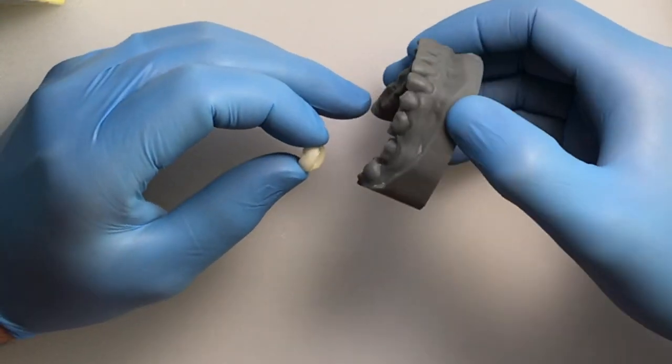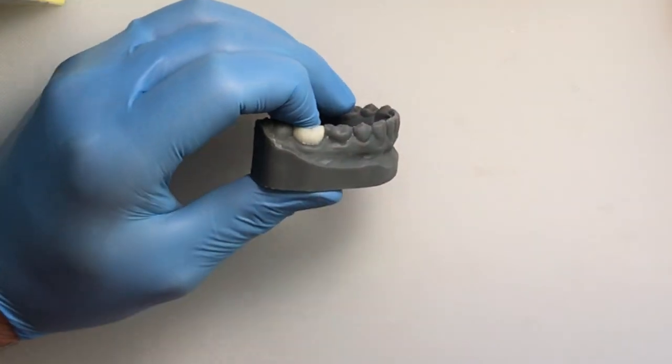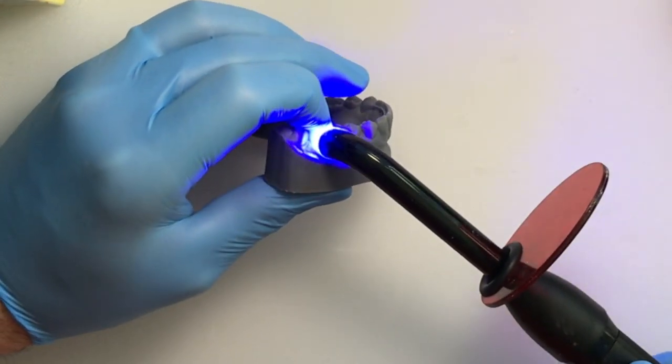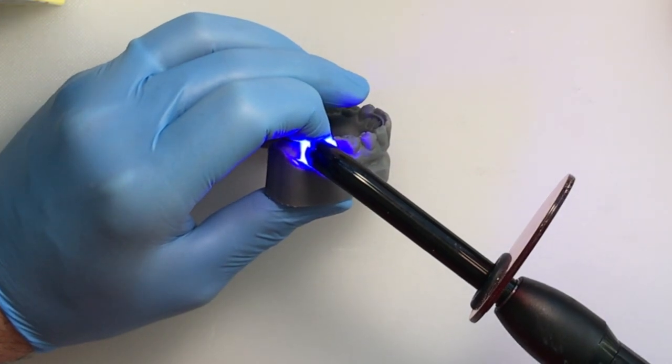Once it's added on, we put it back onto the model. And with a light curing unit, again, cure that so that it is a solid provisional.